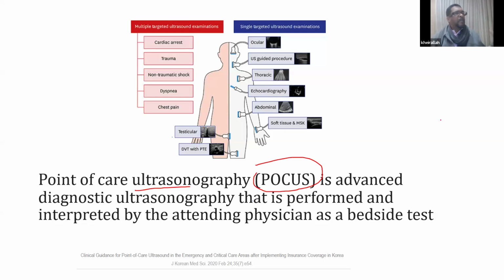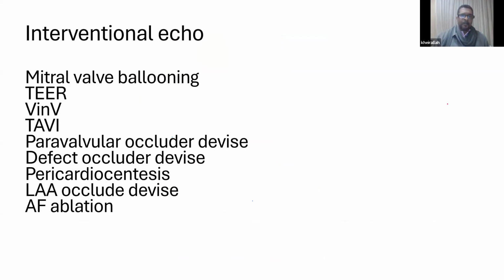It replaces your conventional stethoscope, so you can just hold it anywhere and move around and do it for patients, just like the obstetricians are doing, the rheumatologists are doing, the ER physicians are doing it, the intensivists are doing it for line insertion and stuff like that. So it becomes commonplace, by the way, POCUS. Now do you hear about interventional echo?